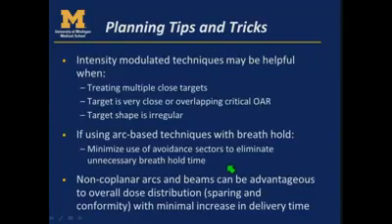Other tips and tricks: IMRT can be very helpful if you're treating multiple targets close together, if the target is really close to or overlapping a critical OAR, or when the target shape is irregular.